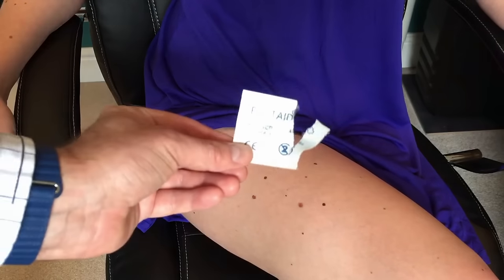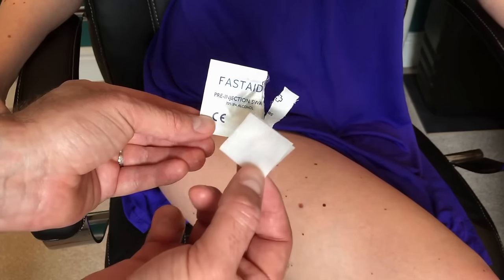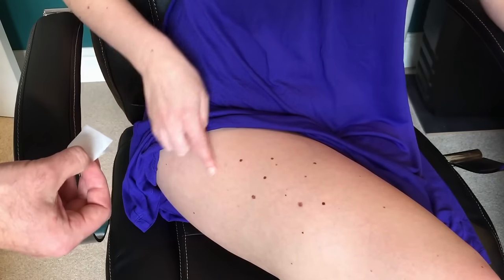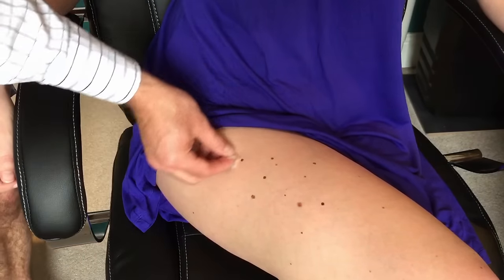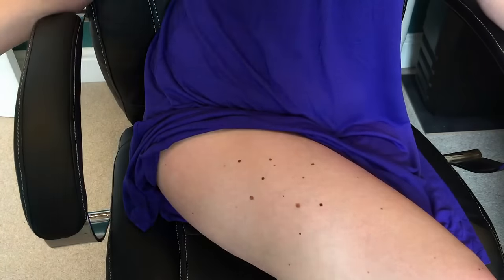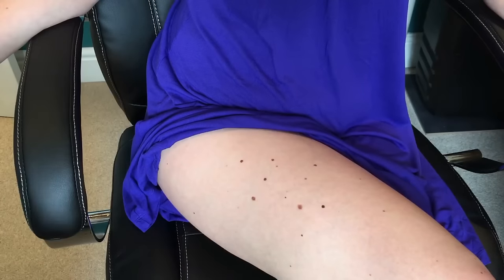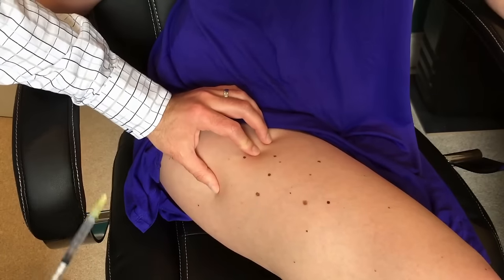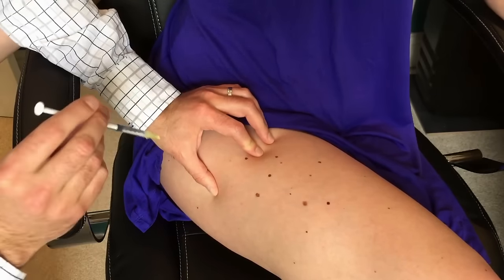Expose the area and choose the site where you are going to be doing the injection. Clean the area with the alcohol swab and let it air dry. If you are using the leg, the upper outer part is often most comfortable. If you are having regular injections, it is best to rotate the sites — use one leg one day and the other leg the next. When you are ready to give the injection, take the needle in your dominant hand and with your other hand, squeeze together the skin and fat.